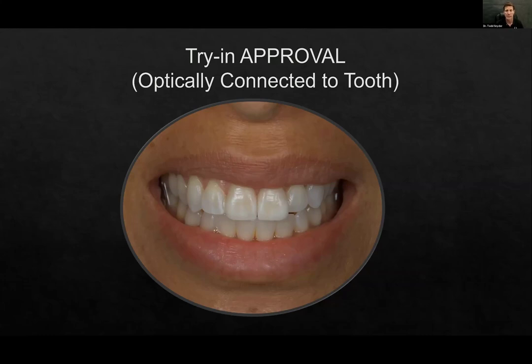So it's misleading. If you're allowing the patient to take a look at the veneers before you adhere them to the tooth structure, they're going to be misled. And potentially it's going to be warmer once you adhere it to the tooth. And if it's warmer and they were expecting whiter, now you're going to have a problem when you hold up the mirror when you're done gluing things in. Okay. So you always want to use a water-soluble try-in paste.